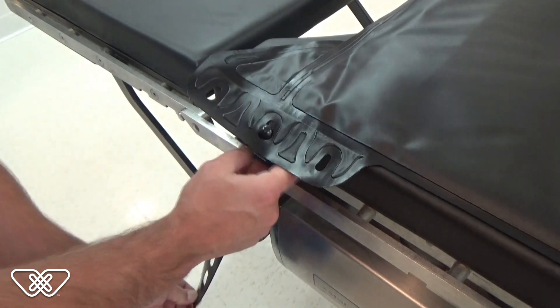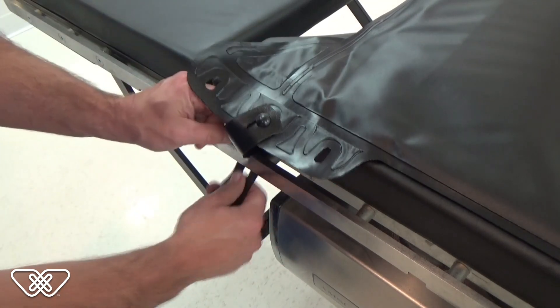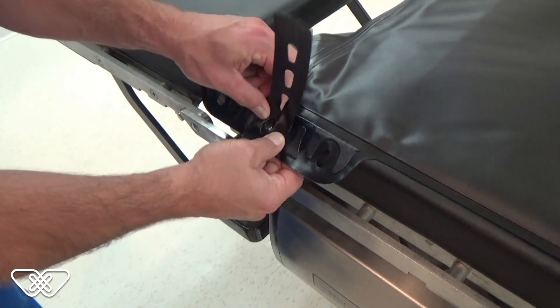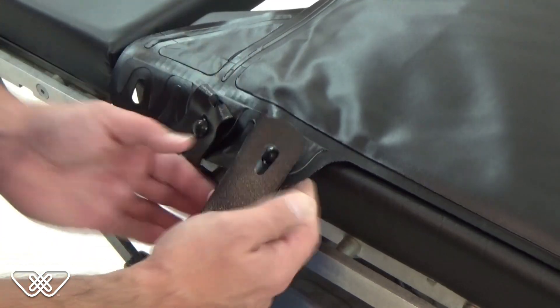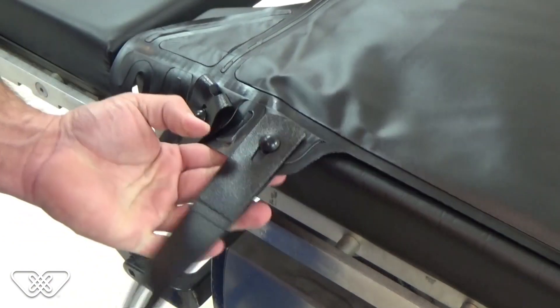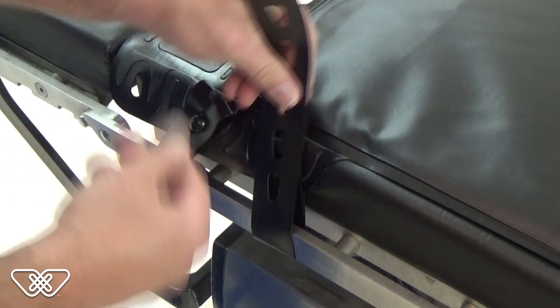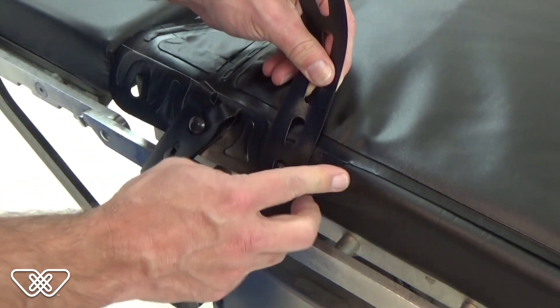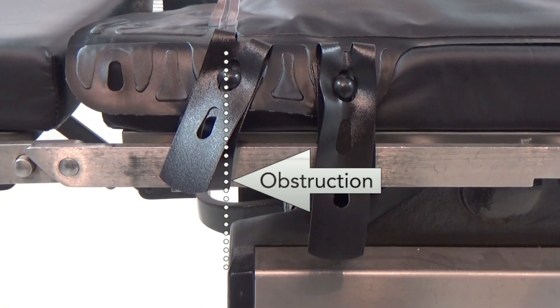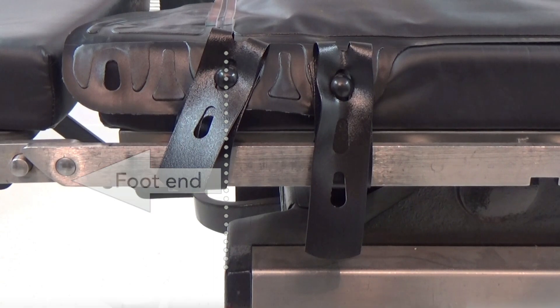Each side of the U300 mattress overlay has four securement loops. Secure a strap in three loops per side for maximized stability. Utilize the loop at the head end of the table and two of the three loops at the foot end of the table. If a loop is positioned over a side rail connector or another obstruction, use one of the other available loops. If necessary, always loop the strap on the foot end side of an obstruction to prevent settling in Trendelenburg position.